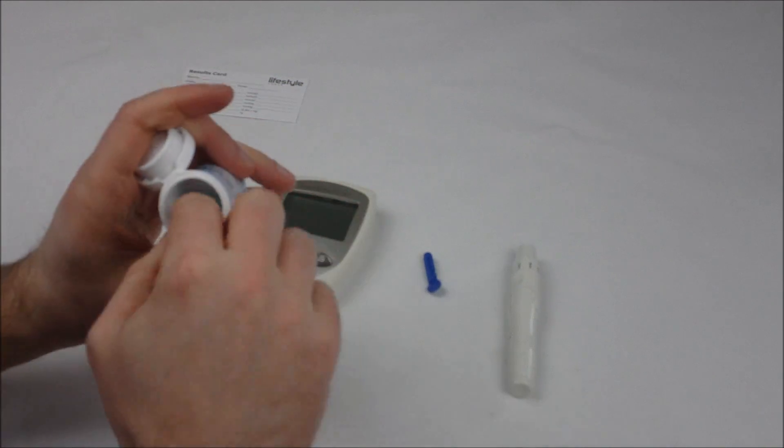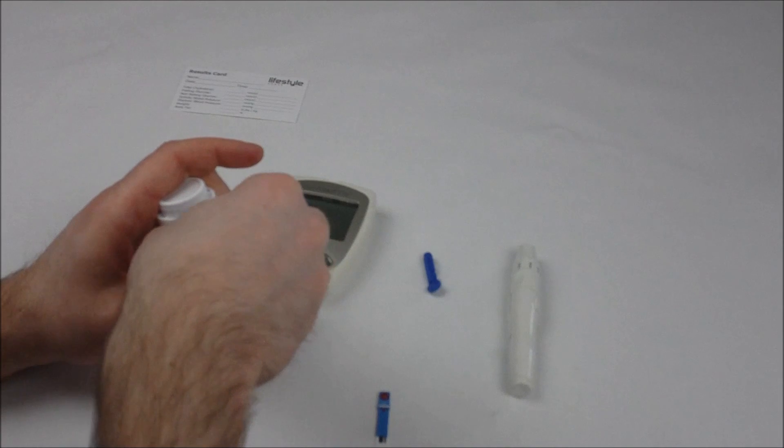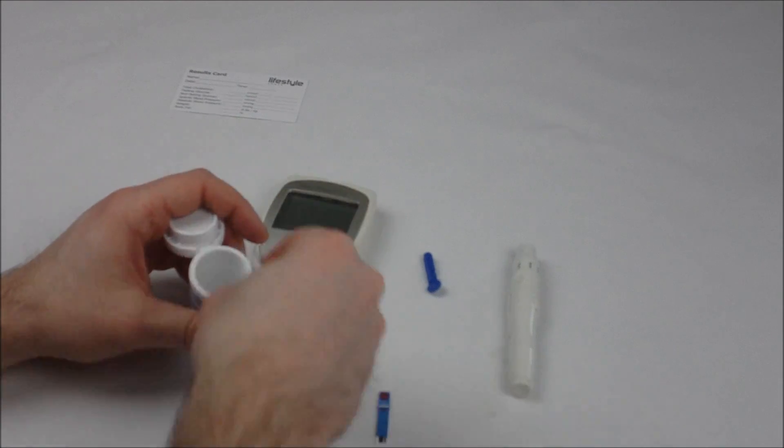Inside your vial you'll find a cholesterol test strip which is colored blue and you'll also find a code key.